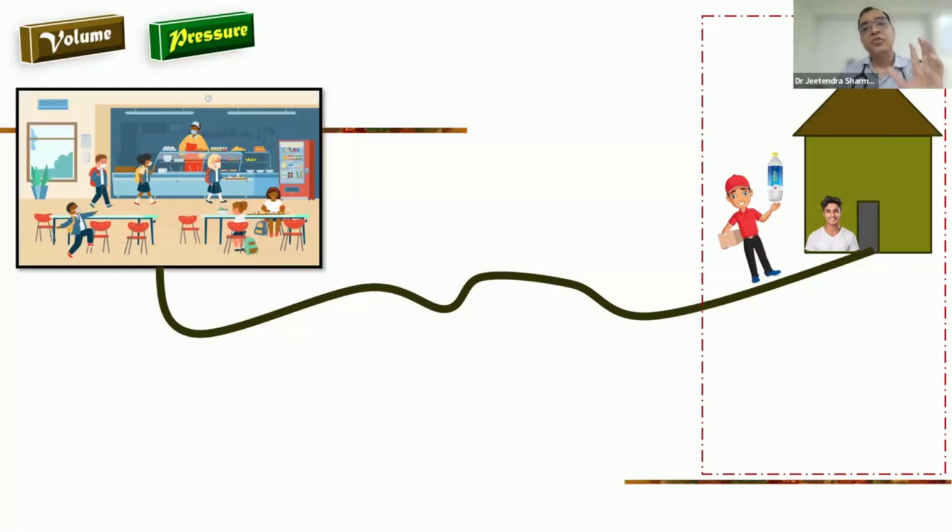In volume control, a volume preset breath is delivered with time triggering. Every time, time is the only trigger, because they just see the time and deliver, and there is no interaction between you and them. The same way, if we decide this much amount of pressure will be given according to the fixed time, it will be a pressure control. Okay, so you understood the two modes now.